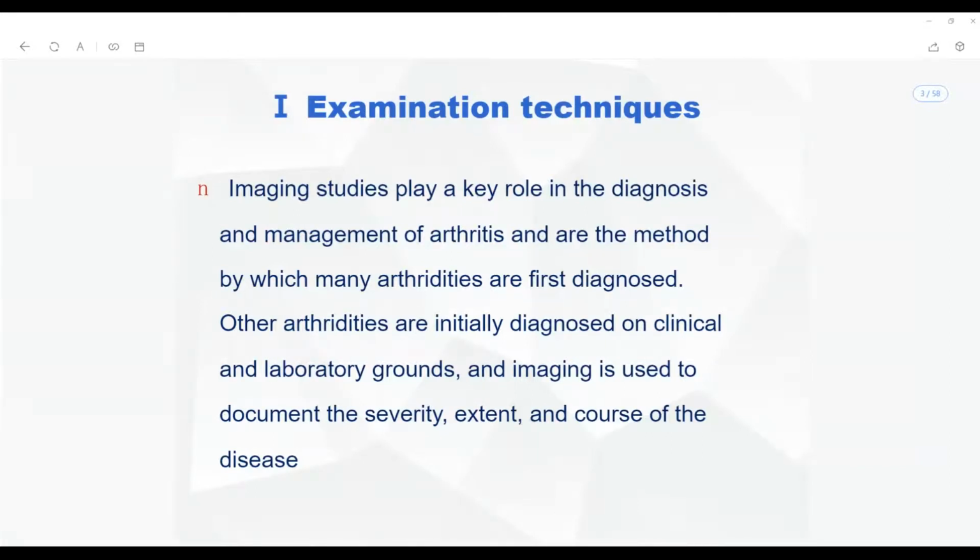So do you think that this is a fair justification? Obviously, no. See, we are not going to confirm anything. If I wanted to confirm one thing, it is that there is no disease existent on an X-ray. And the other thing I'm going to confirm, yes, you are going to talk about a pannus formation, but technically you don't call it a pannus formation here.